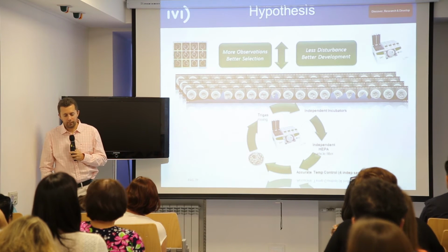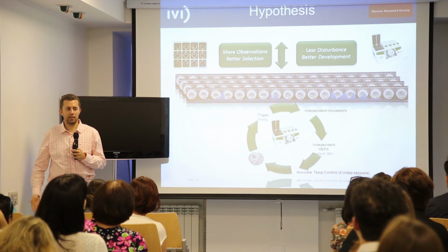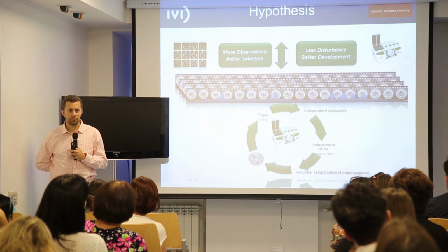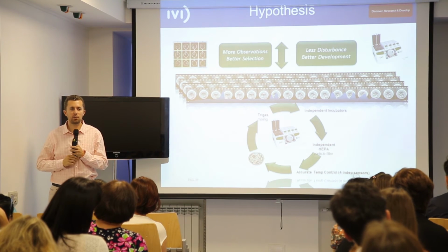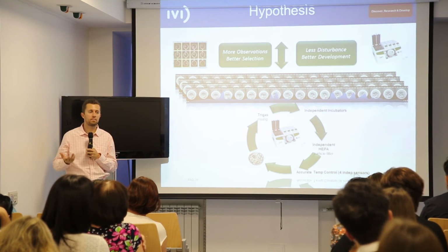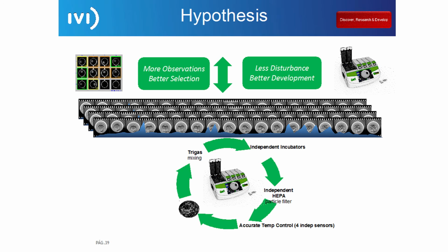So now we have to think about that. If we are observing the embryos better, if we are not disturbing the embryos because we keep them in the incubator all the time, we must expect an improvement, right? We must expect it. So what is in the literature about this?